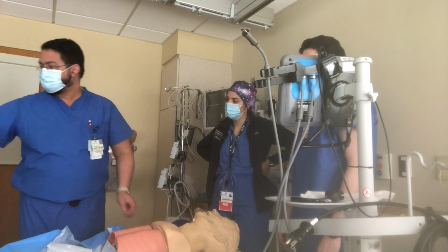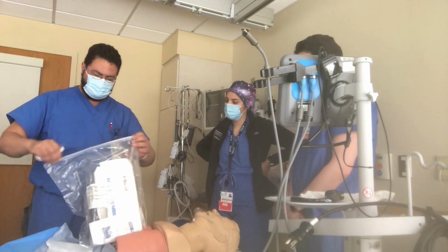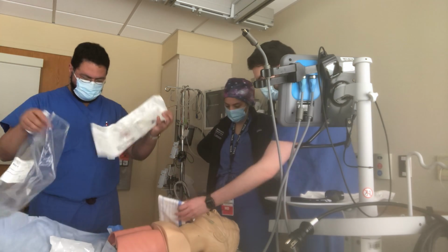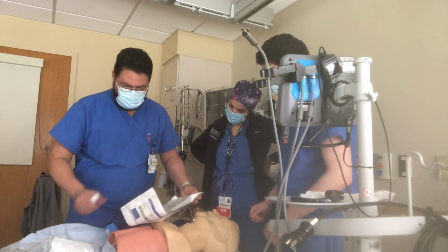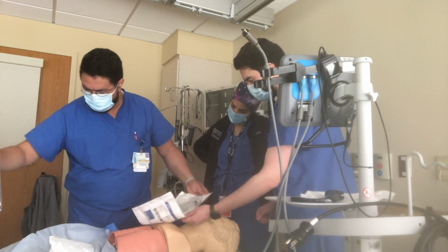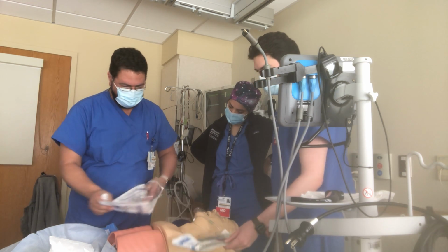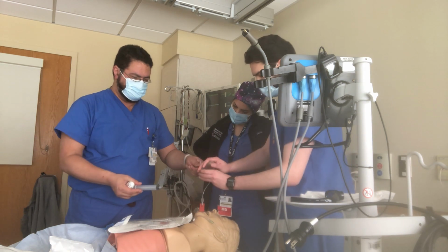This one? Yeah. All right, so I'll get it out for you quickly because we are at 12 o'clock. So right here, that's a component that we don't use acutely, and this one is what we use acutely, and it's missing an endotracheal tube. The first one was an endotracheal tube. Oh, right here. Okay, so remove this.